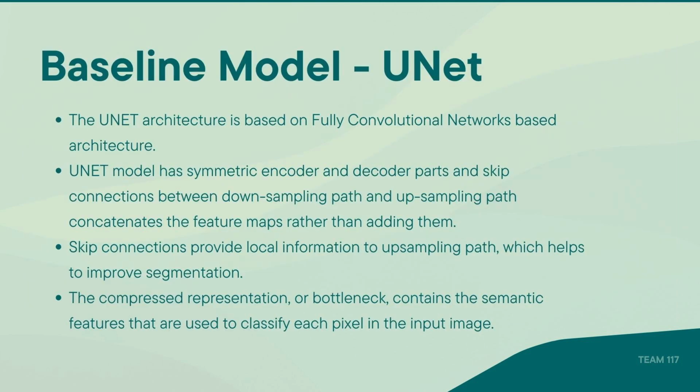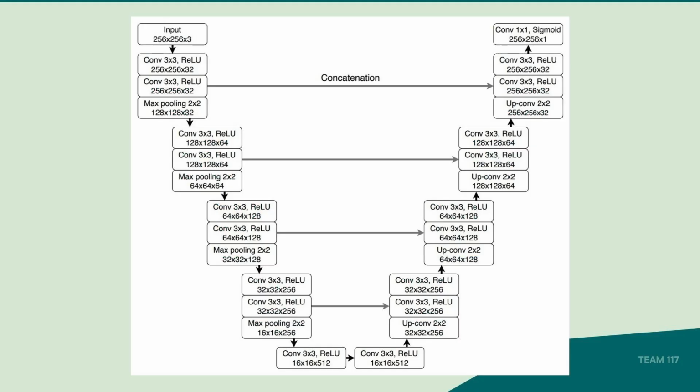As a baseline model, we utilized UNet. The UNet architecture is based on fully convolutional networks. Here is the architecture of the UNet model.